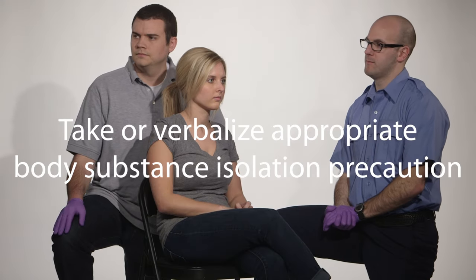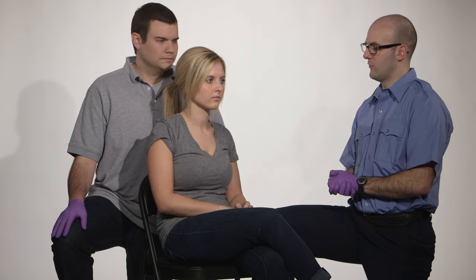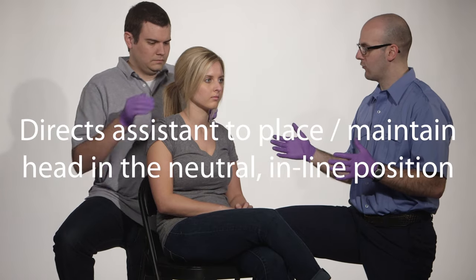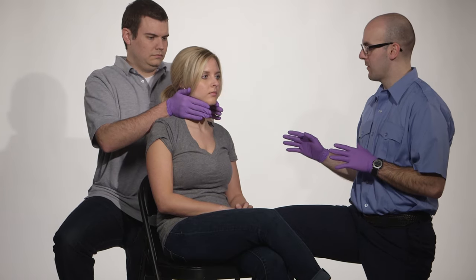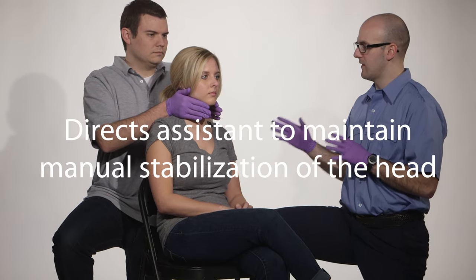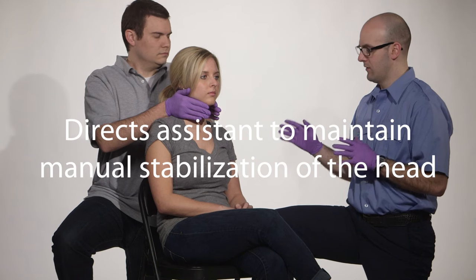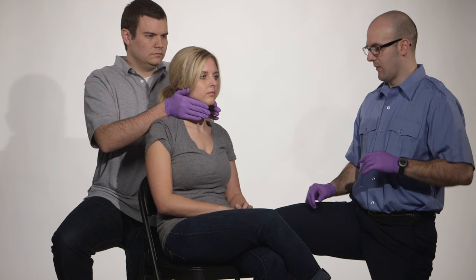BSI. Is my scene safe? Your scene is safe. The first thing I'll do is have my partner place the head in an inline neutral position, and then I will direct my partner to maintain C-spine immobilization. Once he's doing that, I'm going to quickly assess CMS.